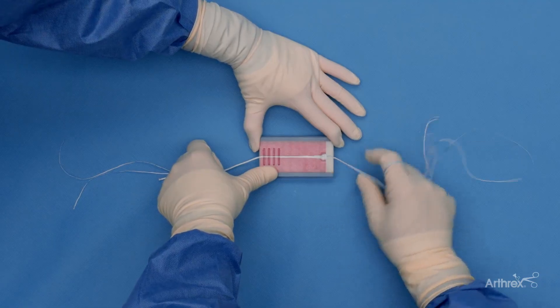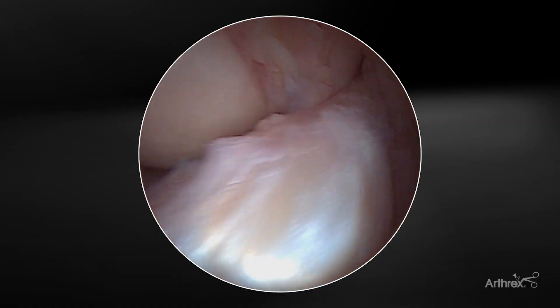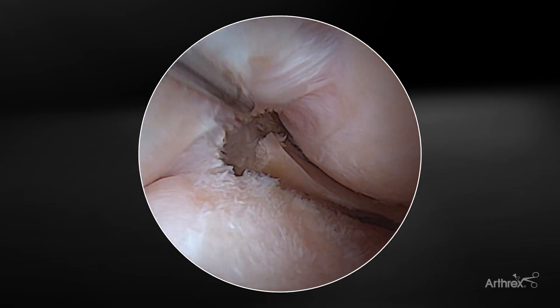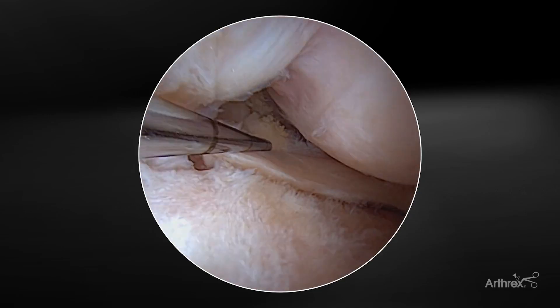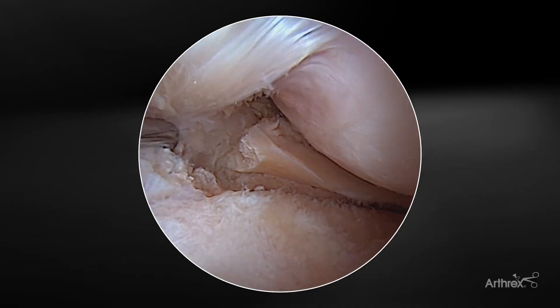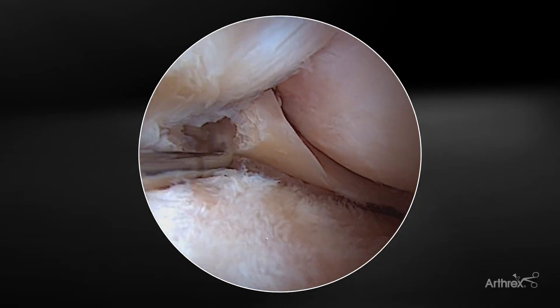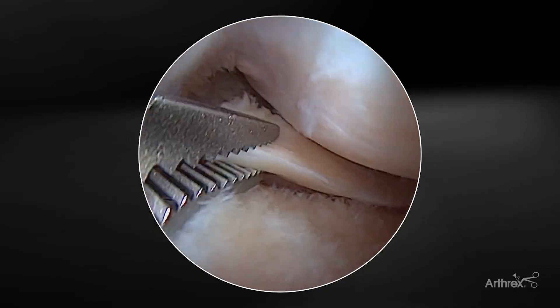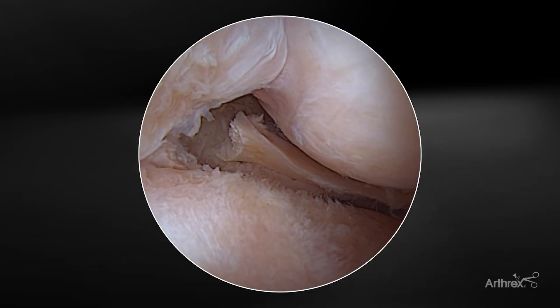The SutureLock device is now ready for meniscus repair. After the diagnostic arthroscopy is complete, you can easily visualize here a lateral meniscus complete root tear. The scope is in the lateral portal to start the diagnostic and initial preparation of the meniscus root. Here you can see the meniscus root tear, which is a very typical tear right off the footprint of the posterior horn of the lateral meniscus tibia. There are some fibers posteriorly which you can also release depending on the chronicity of the tear in order to get it mobilized.